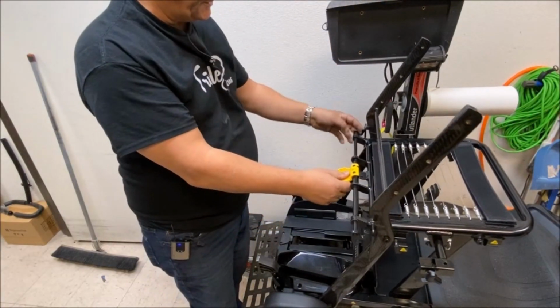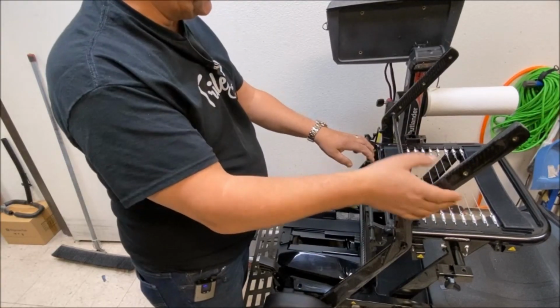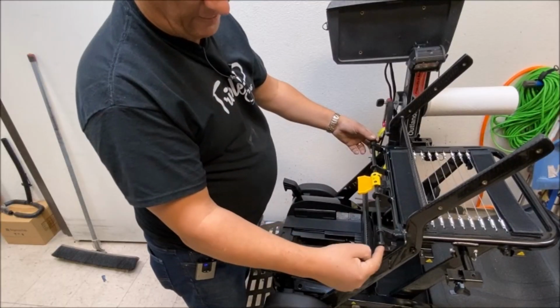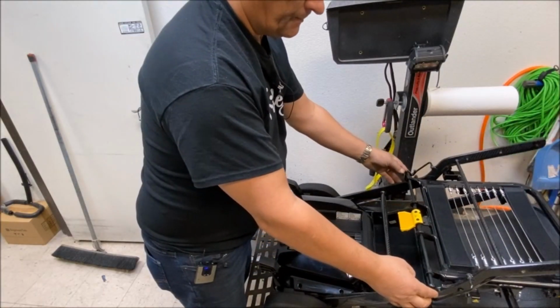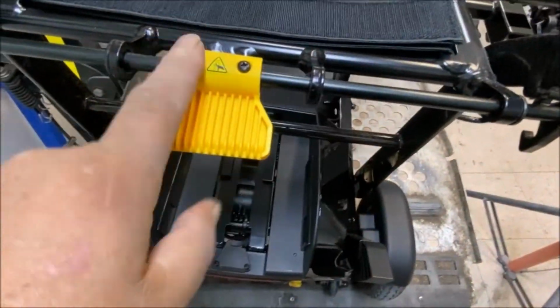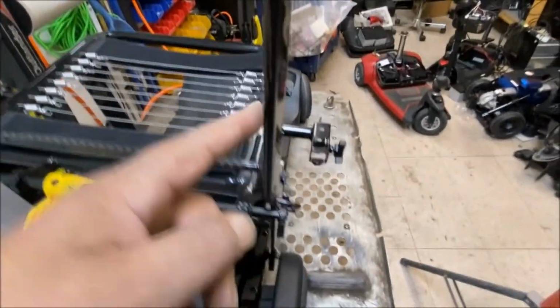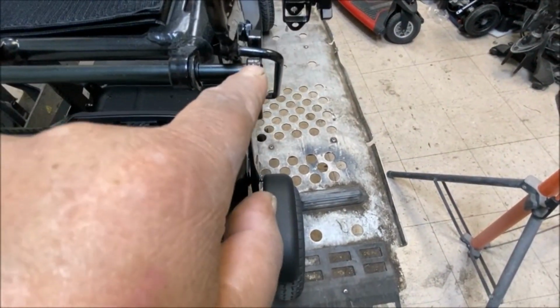No, because this is part of the seat base, so you don't need to remove this if you're just doing this piece here. What you will have to remove is these locking mechanisms. So I'll show you. This is part of the seat base, you don't need to remove that, but anything attached to this, the uprights. So this is a seat base, but I need to remove these.